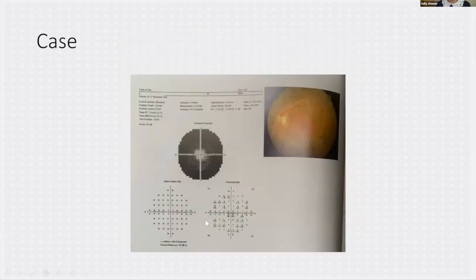This is just to show severe visual field loss from previous retinal laser. So in the past, as you know, with PRP laser, people used to do it quite aggressively. There was a lot of destruction of the peripheral retina, to the extent that patients were literally left with a small island of vision. Thankfully, this is now very rare and hardly ever seen.